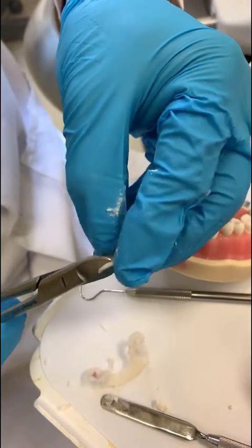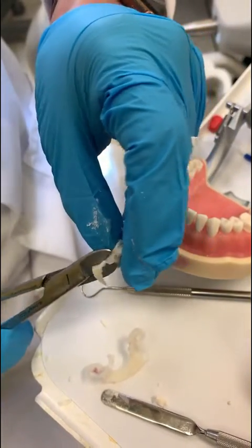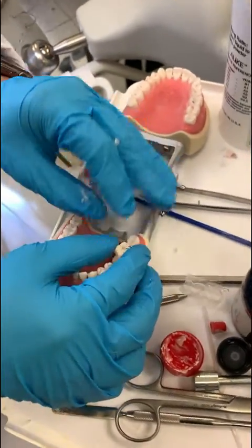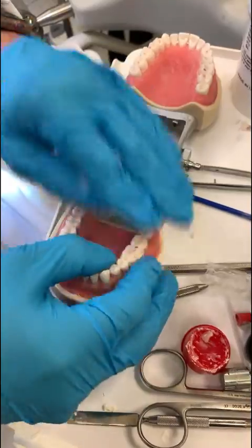Cut close to the margin, just like that. Once you're done we're going to put this one back on the tooth and press just like that.